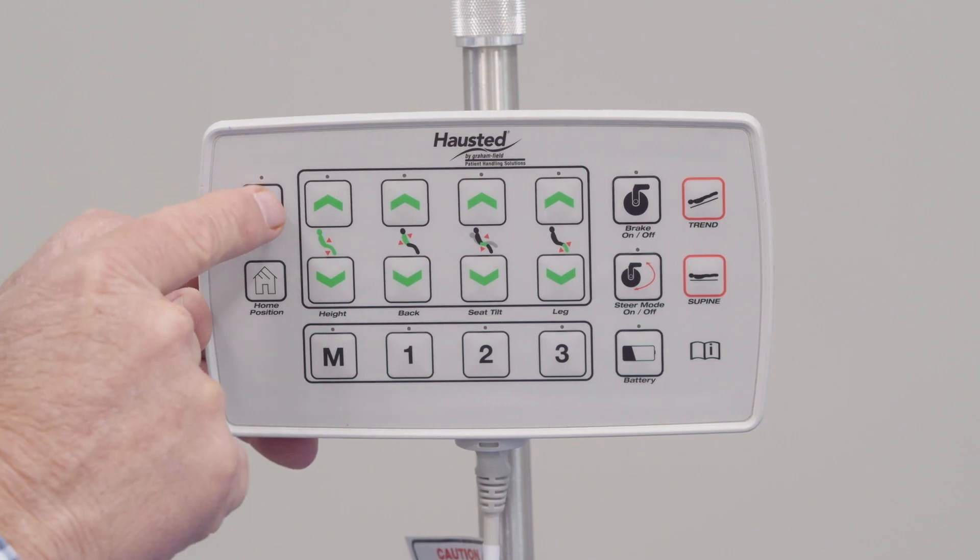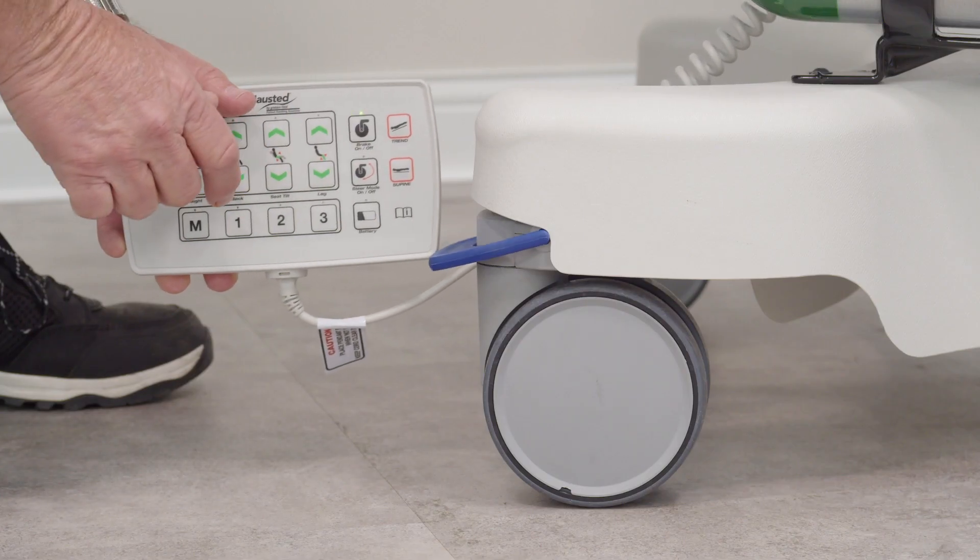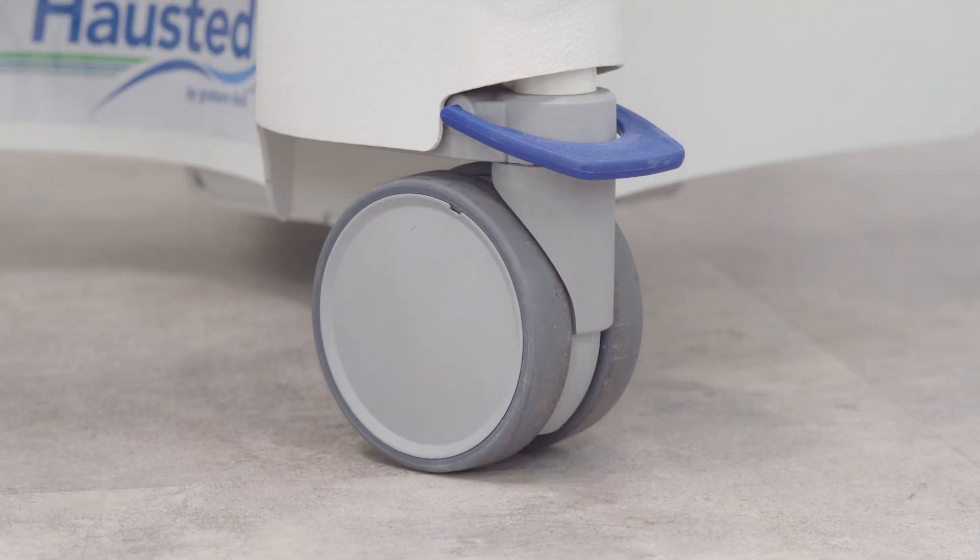If you push the lock button one time, the unit will be ready to perform any function. When the LED light is on, both the pendant and casters are now active and ready to move.